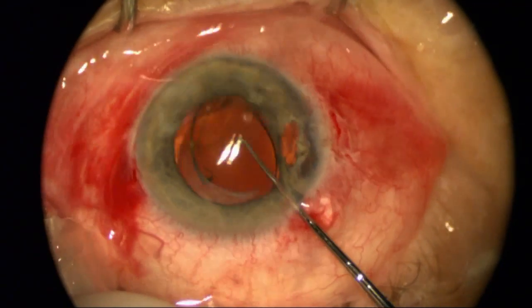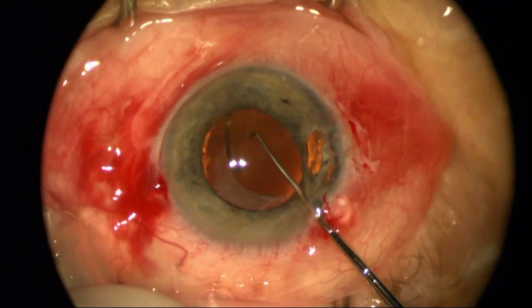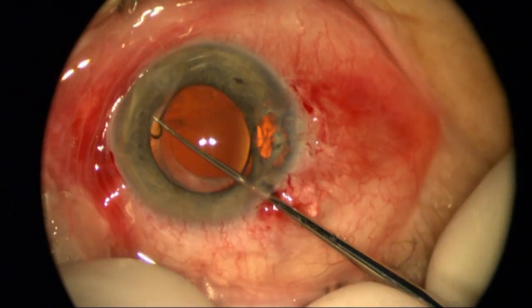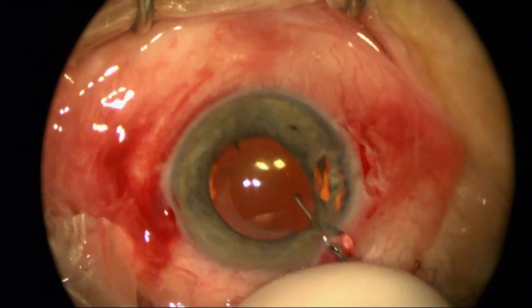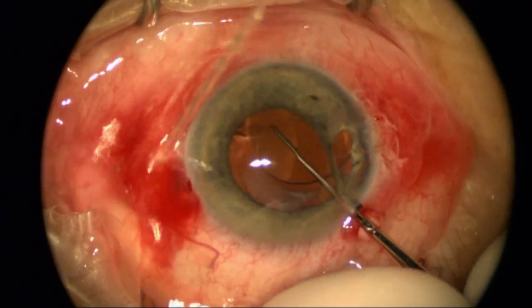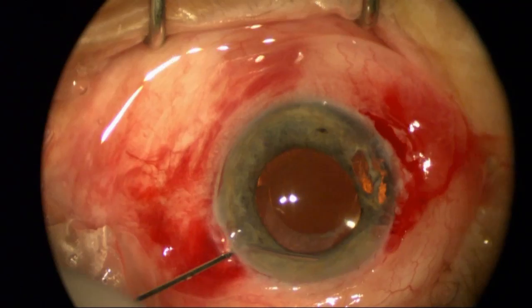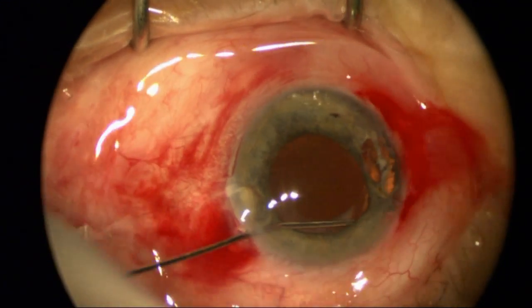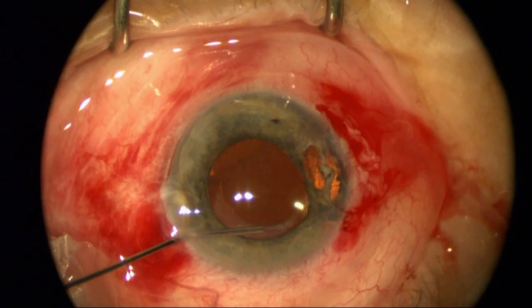However, the other loop is cocooned into some scarring, and it's hard to get it completely centered — it keeps wanting to bounce back. So I need to get this other loop out of that cocooned scarring, rotate it around. I finally achieved excellent centration and got the bag completely open.